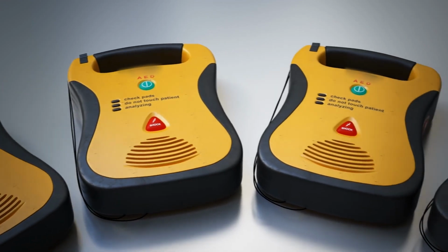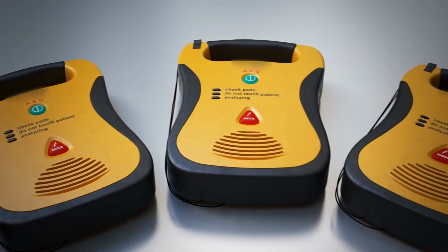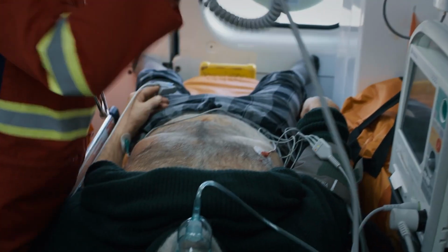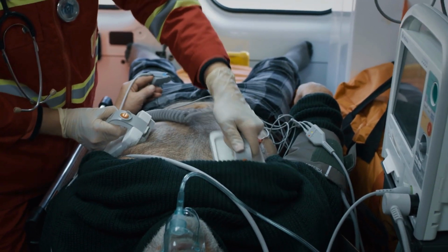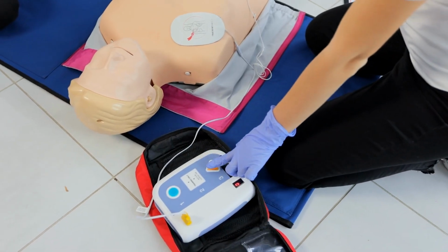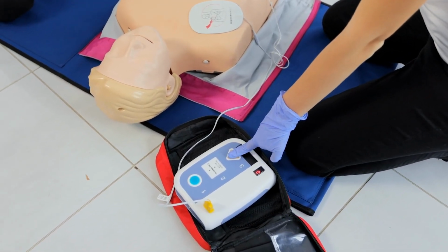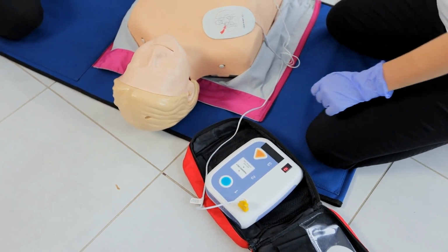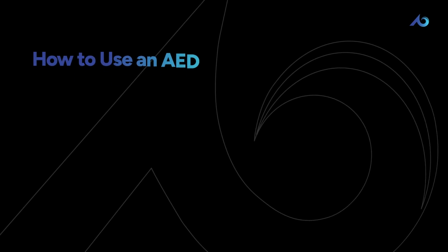Many workplaces and public buildings have AEDs on site. If yours doesn't, emergency medical personnel will bring one in response to your 911 call. It's important to know how to use an AED. It's even more effective than CPR. An AED is easy for anyone to use. All you do is turn it on and follow the voice prompts.